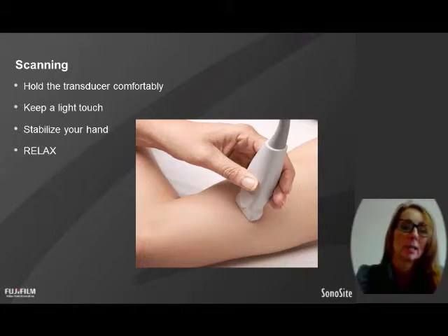Make sure you stabilise your hand, particularly if you're scanning with a lot of gel. It's very easy to slip off and move around, so stabilise yourself and relax.